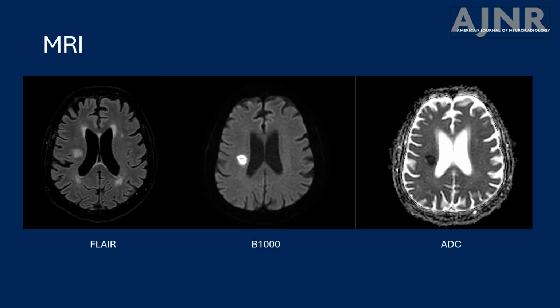But CT is not the only imaging technique that we have at our disposal. Sometimes we might also have MRI. MRI might not always be available and is time consuming, making it less routine in the hyperacute phase, but valuable in the subacute phase as well.